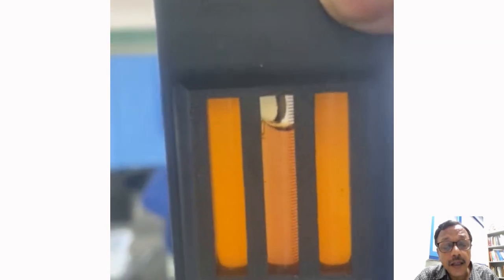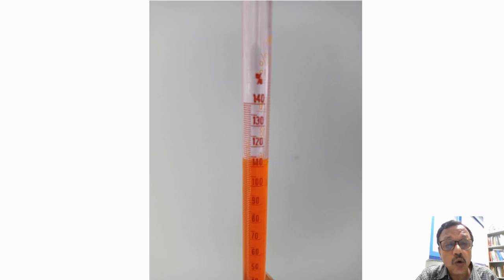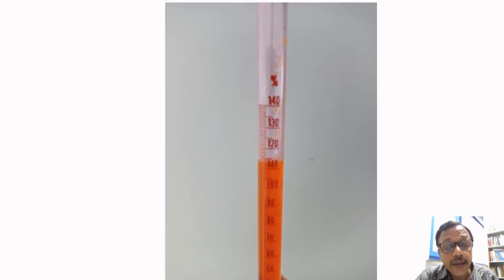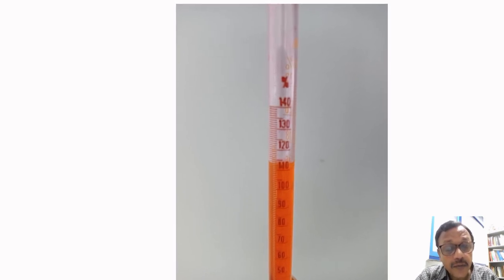So you should never take out the stirrer from the tube. You hold the stirrer in such a way in the tube that it doesn't come out, and you hold the comparator box along with the hemoglobin tube in natural light to match all the three test tubes. Once it matches, you take out the tube and directly you can see the hemoglobin value in terms of gram percentage.